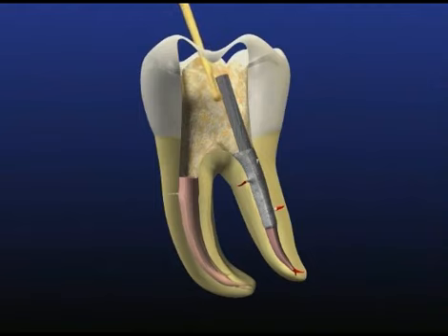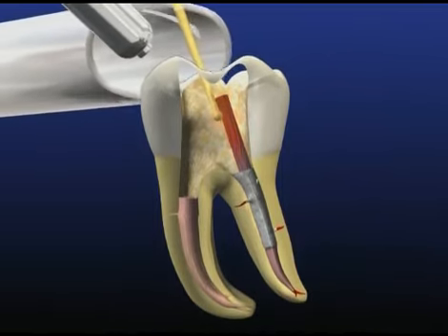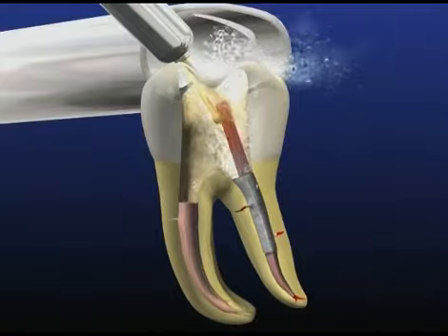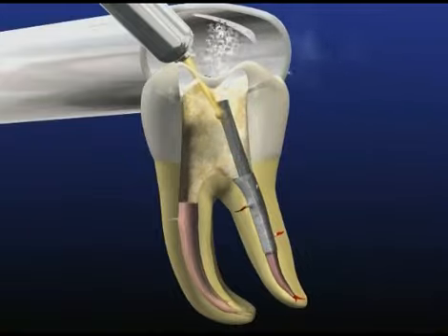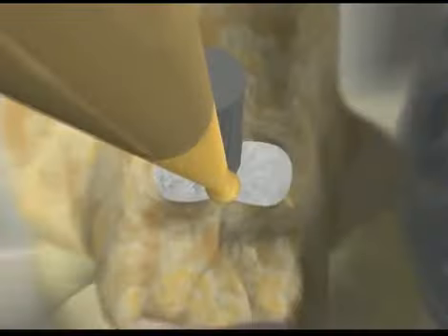circumferentially and up and down along its exposed length. Experience suggests most posts can be safely removed in approximately 10 minutes. This is my 10-minute rule. However, ultrasonic procedures generate heat, particularly when removing large conductive metal posts. Therefore, use an external water source to reduce temperature and eliminate heat transfer.